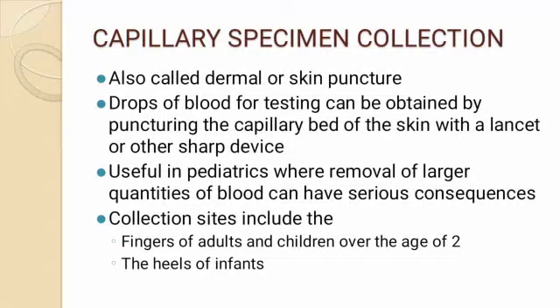Collection sites include the finger of adults and children over the age of 2, heels of infants.